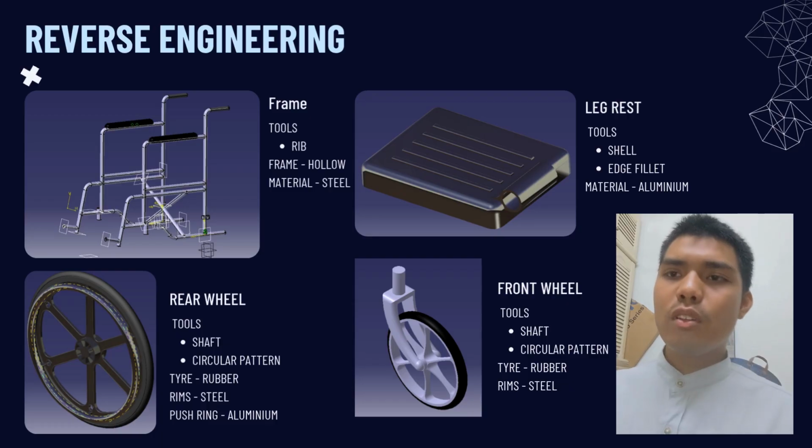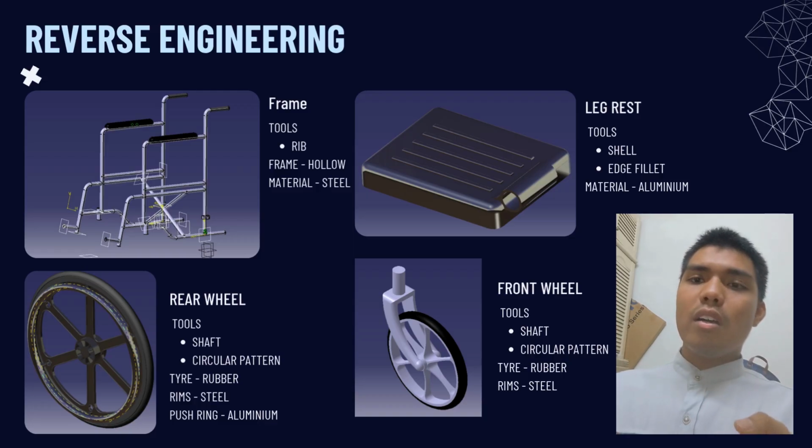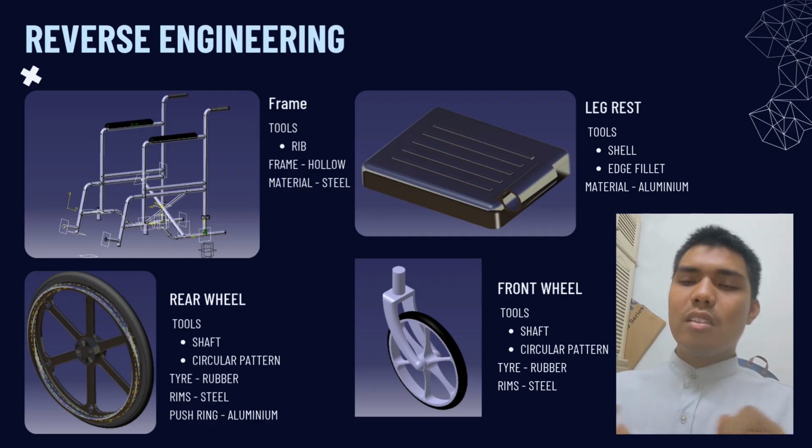For the first one, which is the frame, we need to determine the outer diameter and inner diameter. So when we measure the wheelchair, we pull out one of the wheelchair handles, and we can measure the inner and outer diameter by using a caliper. So we get the value of the inner diameter.